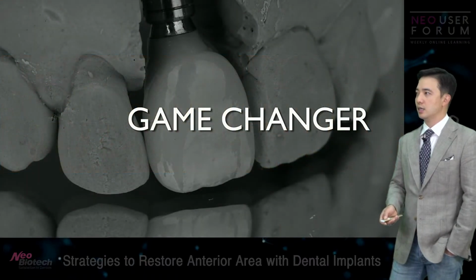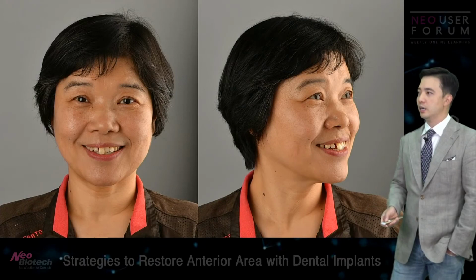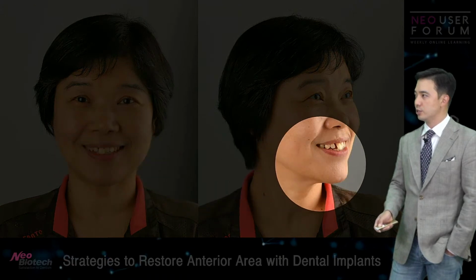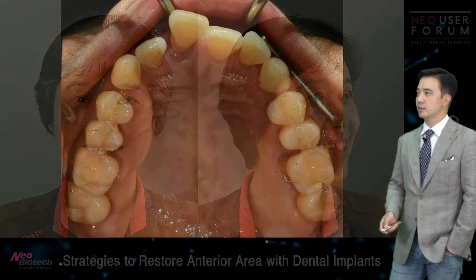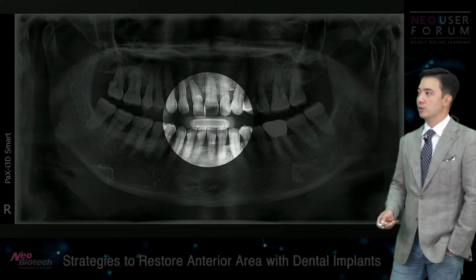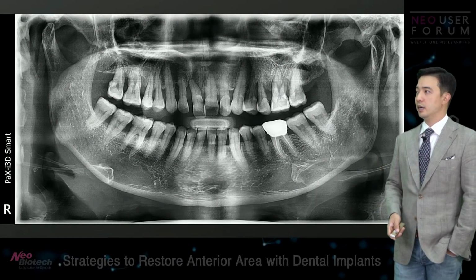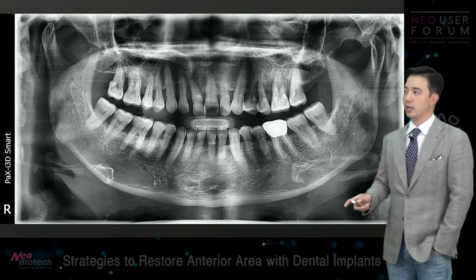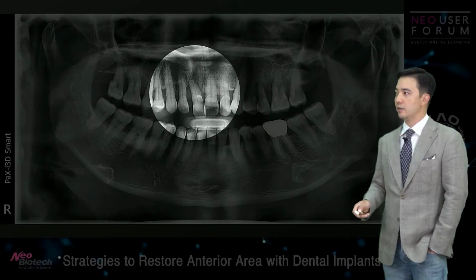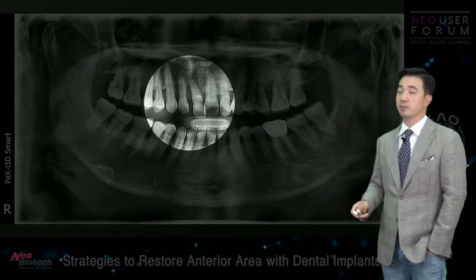So this case is also another orthodontic case. Patient comes in, she came in with a long front tooth right here, 11. That's why she came in, okay? Well, the perio was really, really compromised, the only thing we could do was to just extract it. But as you can see, the bone level at the distal of number 11 was really, really low. And look at the marginal bone level on the mesial aspect of number 12.